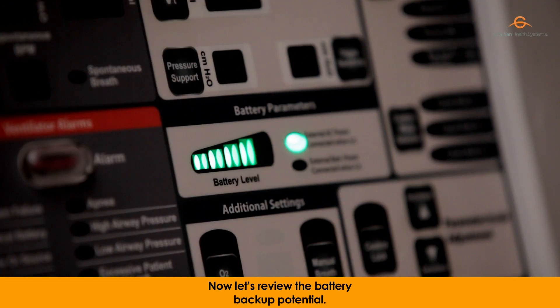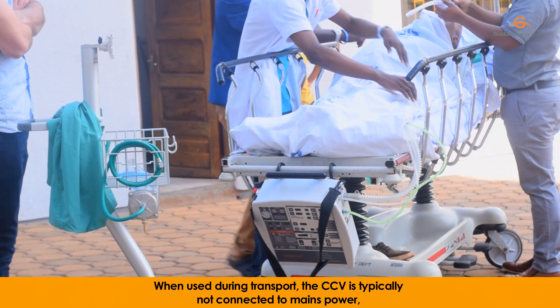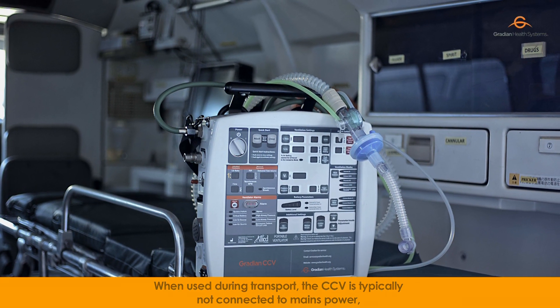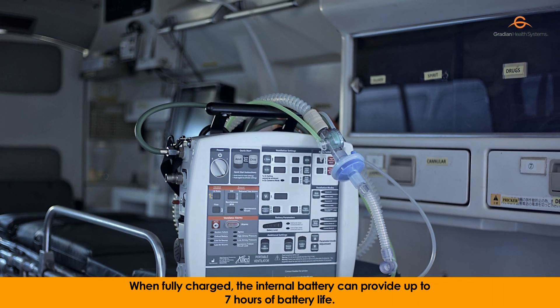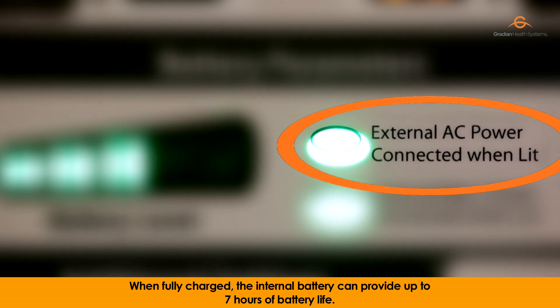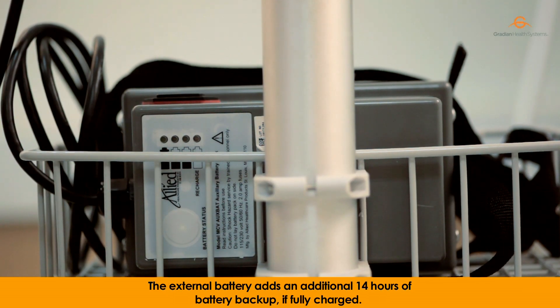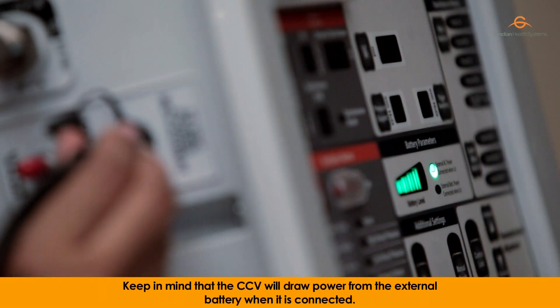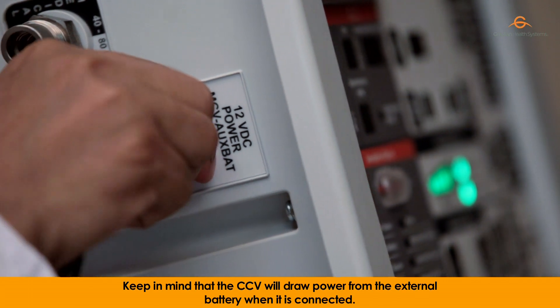Now let's review the battery backup potential. When used during transport, the CCV is typically not connected to mains power, so it will operate on battery backup. When fully charged, the internal battery can provide up to 7 hours of battery life. The external battery adds an additional 14 hours of battery backup if fully charged. Keep in mind that the CCV will draw power from the external battery when it is connected.